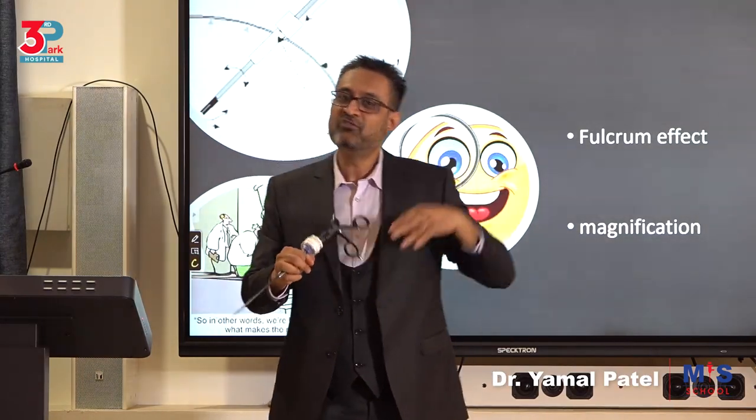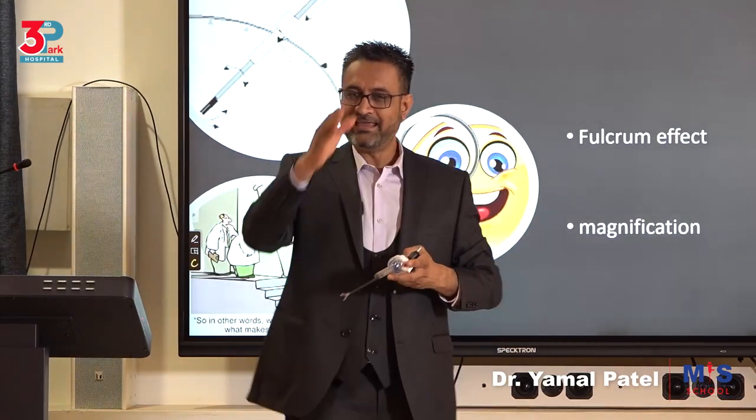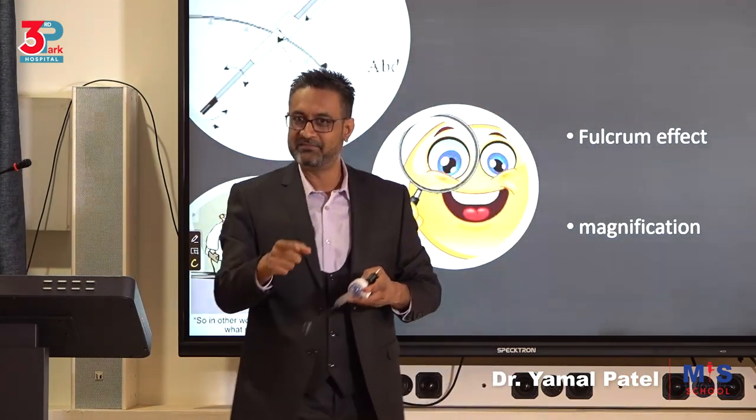So you'll have to train yourself that, listen, this is a fulcrum. I'm not supposed to move in the direction that I want to move in the screen. I'll probably move opposite to get that movement. You understanding what I'm saying?